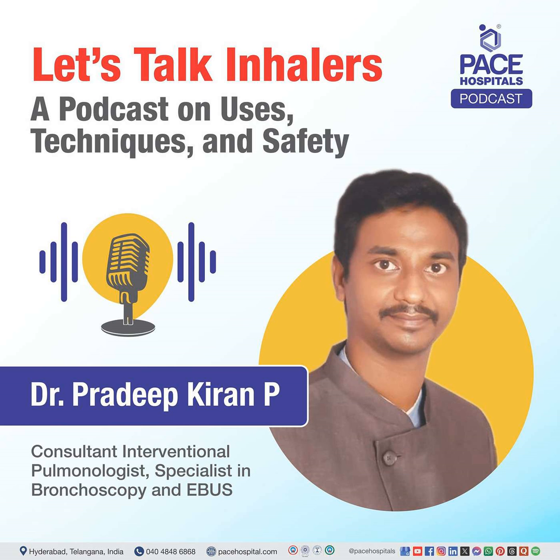Once you press these buttons, what happens? You see there are needles coming out. Small sharp needles will be coming. So these needles will be puncturing the capsule and making holes on the sides. So once you have locked this capsule, then press this once, twice, thrice. It's okay, no problem.